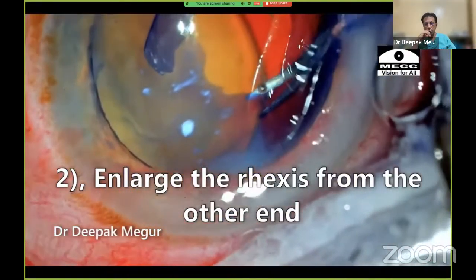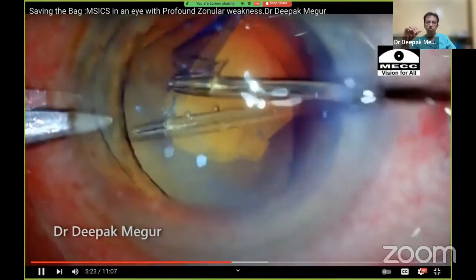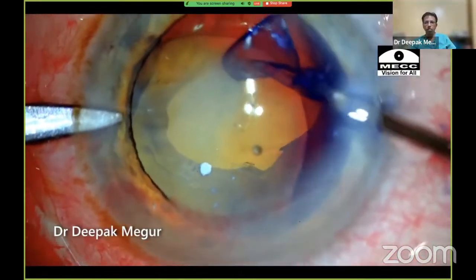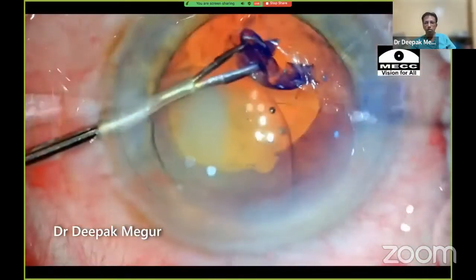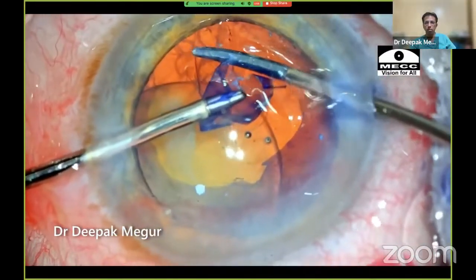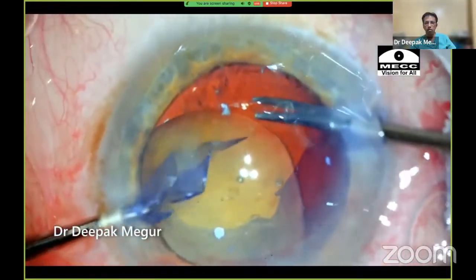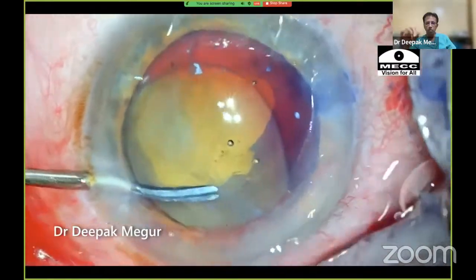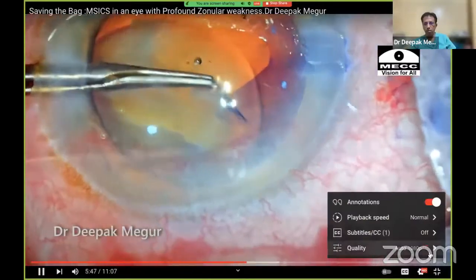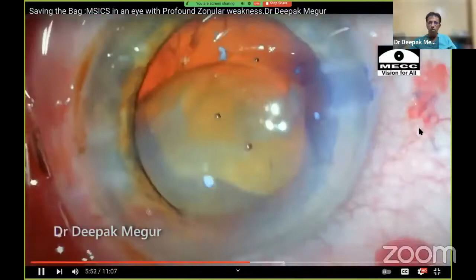Option two was to make a nick at the other side of the capsule opening and extend from there. As I reach the weak area again, I can't get through it. So using micro forceps in the left hand and micro scissors in the right hand, I give a small nick and create an opening. The rest of the capsule needs to be trimmed. A tangential cut is given, and very carefully, the enlargement of the rexis is done. I now have some semblance of a capsulorrhexis.